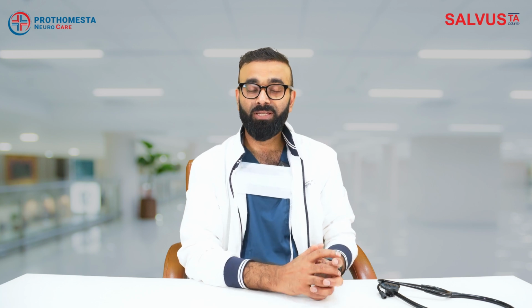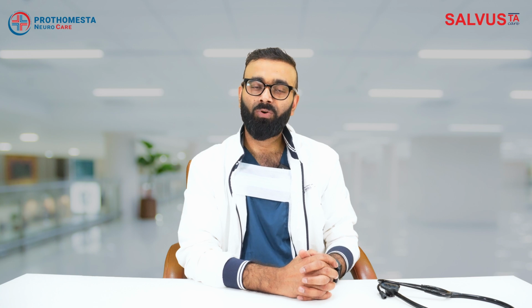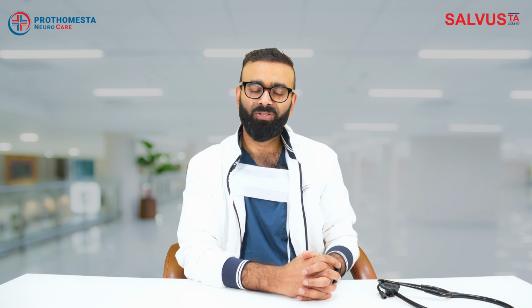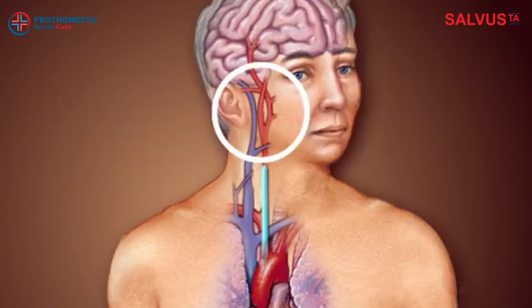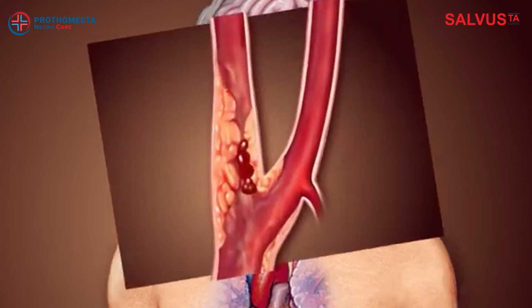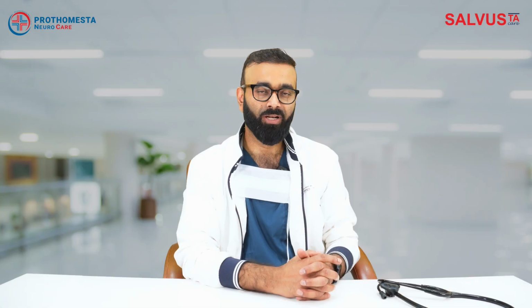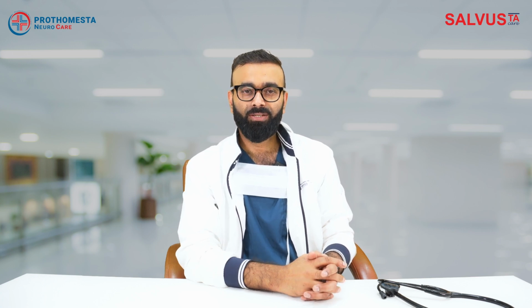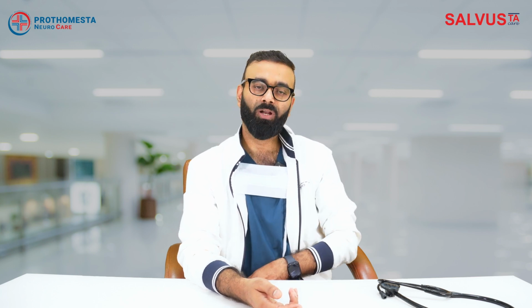So when there is a significant block and a clot goes from there inside the brain, causing stroke or stroke-like symptoms, or there are ulcerative plaques or other indications, carotid stenting is a very effective way of treating carotid stenosis, as effective as carotid endarterectomy if it is performed by an expert interventionist. And we reach here through the radial artery or femoral artery.